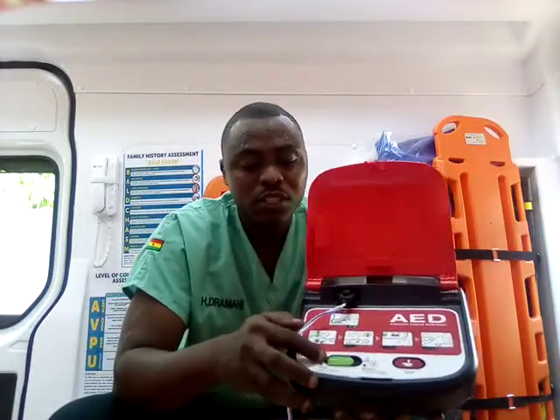Now, you realize that we have a green button, and this green button is what we call the patient mode, either for pediatrics or adult. When you shift it to the right side, that means you are working on a pedis. You shift it to the left side, then that means you are working on an adult. Now we are also advising that we need to be extra careful. When you are working on an adult patient, make sure you shift the patient mode to the adult side, and then it tells you adult mode. If you are working on a pedis, please make sure you shift it to the pediatric mode. Then it alerts you pediatric mode.